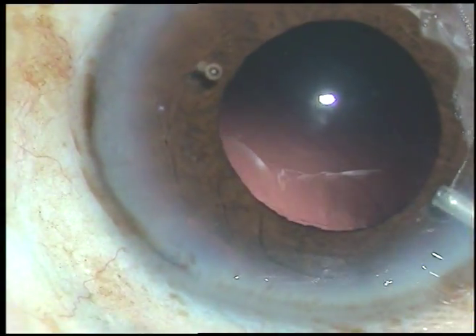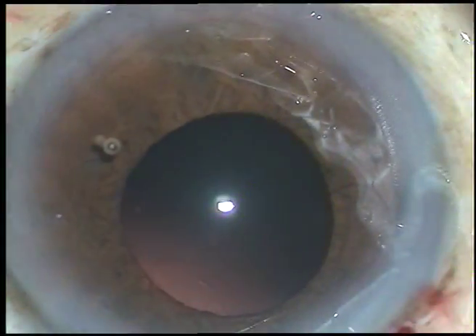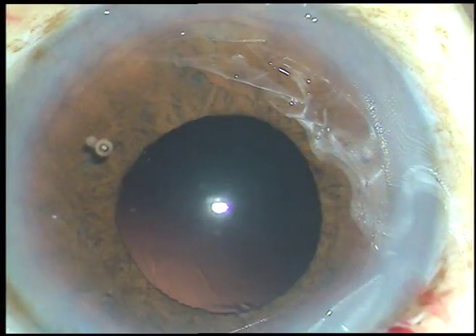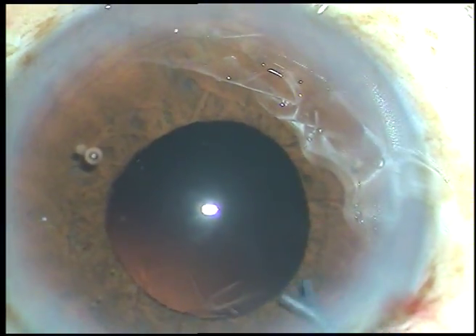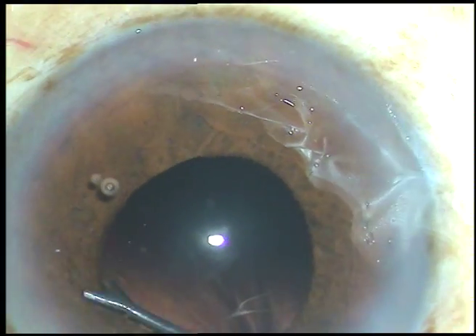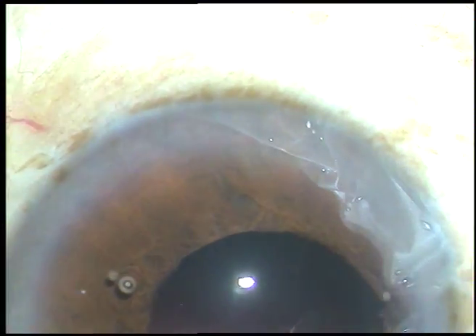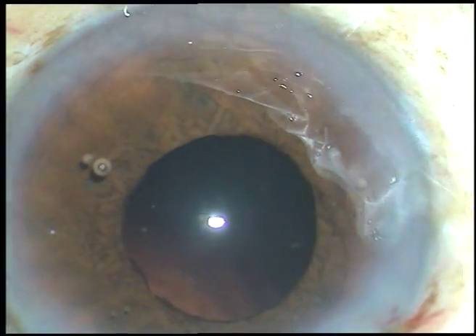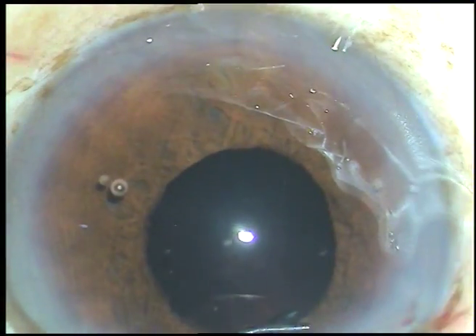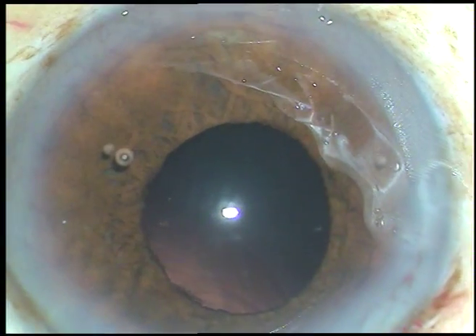Here it is — viscoelastic substance has been injected. Now with this Shepard instrument, I retract the iris and check if there is any cortex anywhere. I go through the side port and check the sub-incisional area.